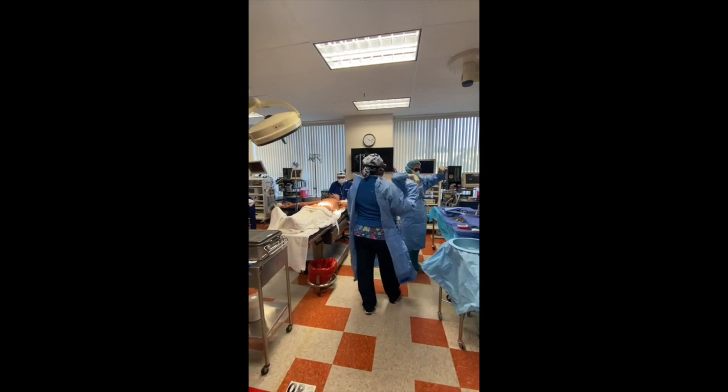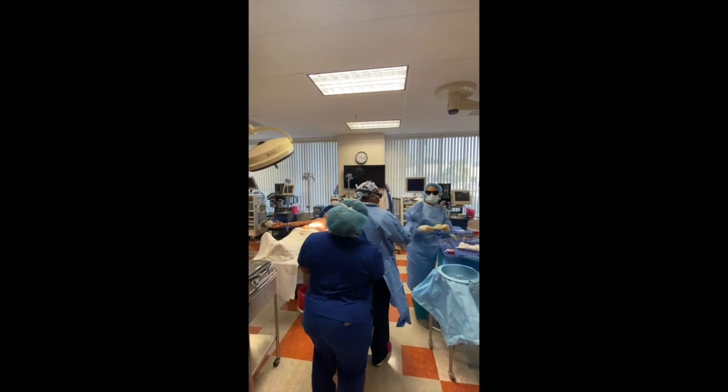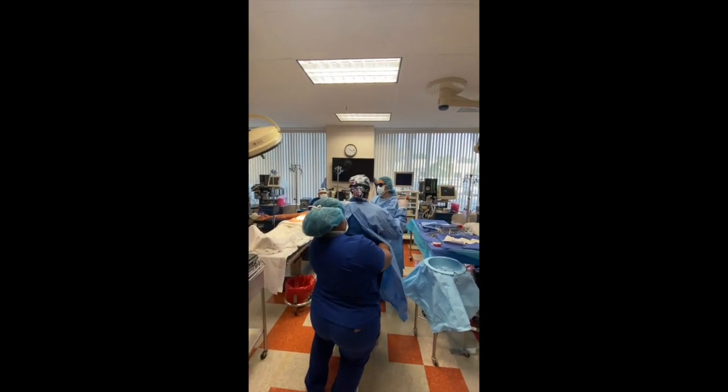Can I get an anesthesiologist with a mask on, please? Seven first, right, doc? Yes, please. Okay, great. Thank you. You're welcome.